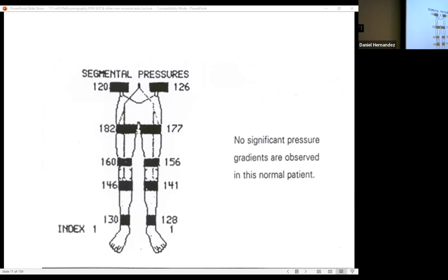Up to 0.5, so from 0.2 up to 0.5. Shouldn't claudication be 0.8999? You're being too specific. If you nail it on the dot, I will pay you $1 million. You're going to be on one side of that or the other.